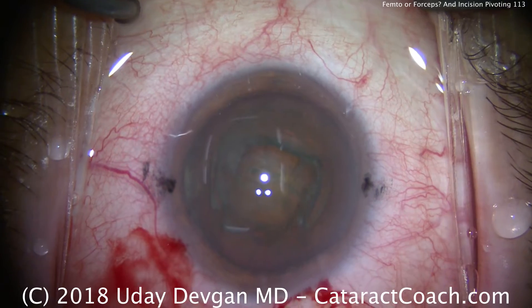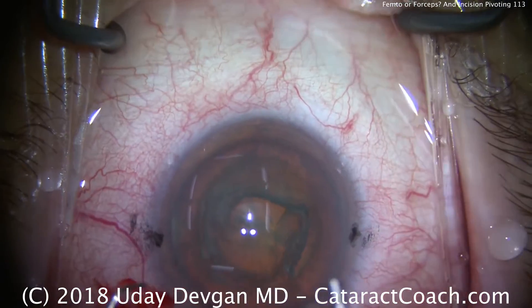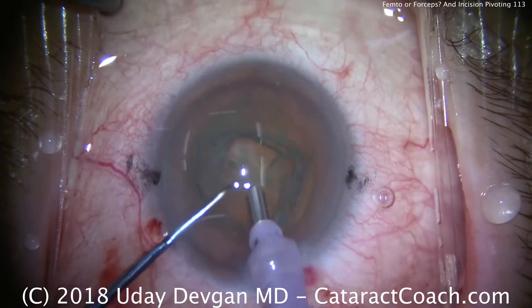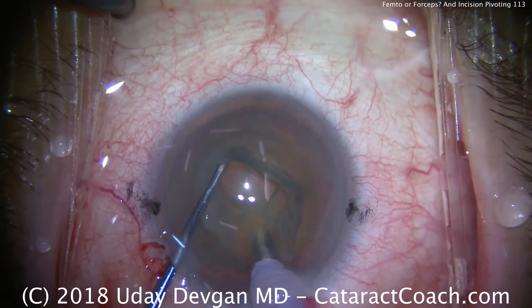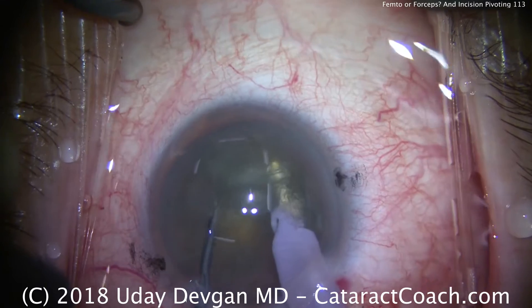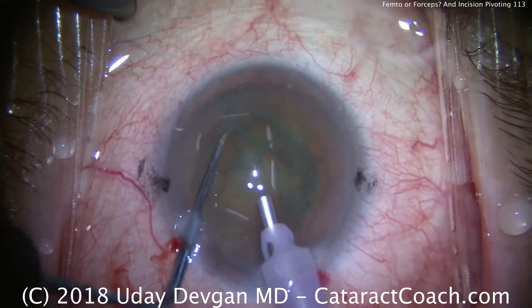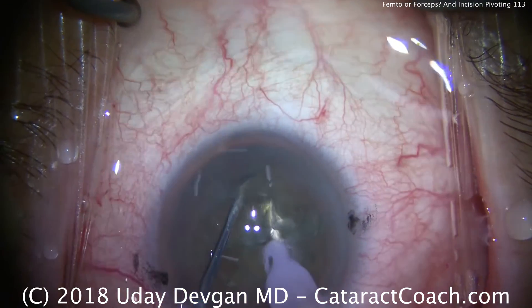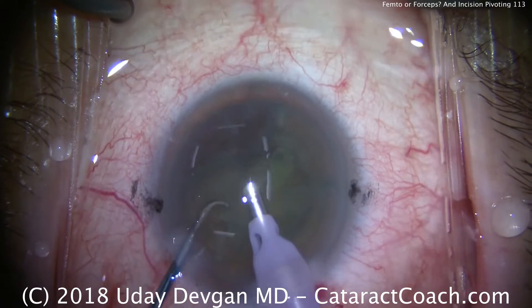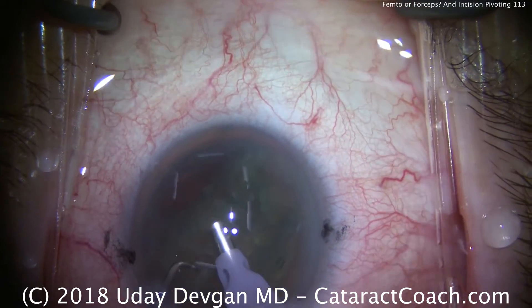The same concept of pivoting in the incisions applies with the phaco probe. We put in the phaco probe in the right hand and the chopper in the left — you can certainly switch hands as well. Look at the lights in the center of the cornea: how they stay relatively fixed. They don't move around; the eye stays in primary position. We did an initial chop that didn't fully propagate through, so we'll rotate the nucleus, buzz again, place the instrument, and chop again. Now we've got a little piece we can bring up.